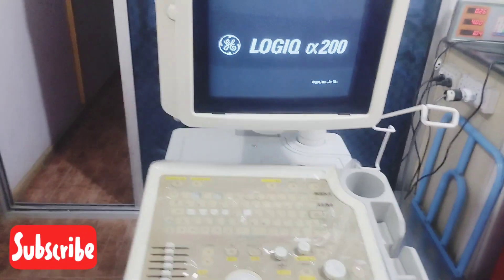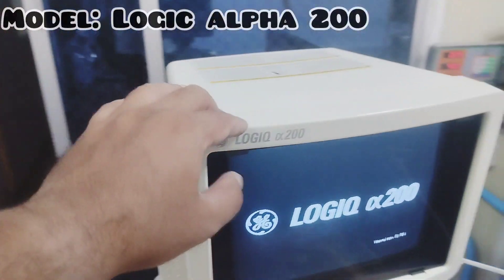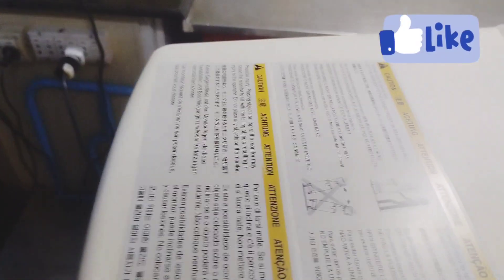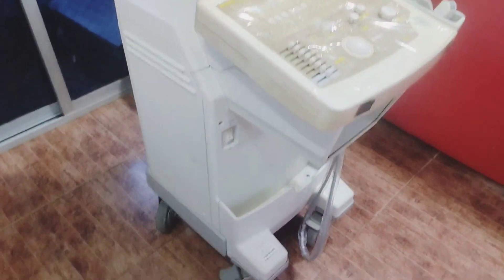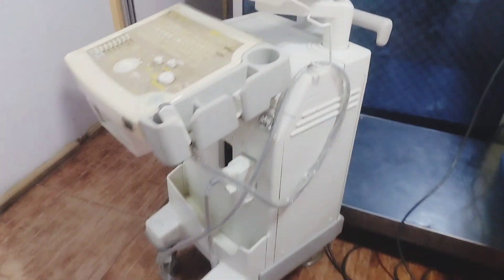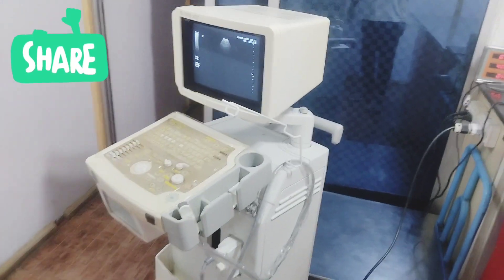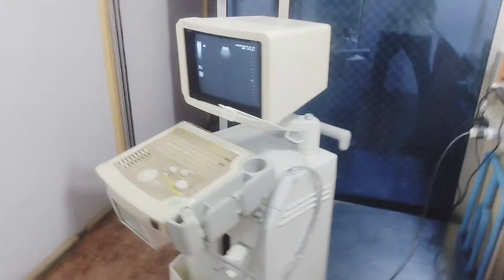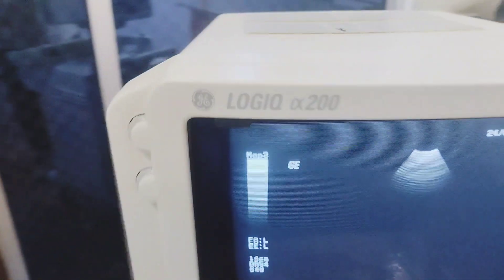What is the model? Logic 200 Alpha. Chinese or Japanese? Chinese — Airbus, Mashallah, it's a fresh Airbus. It's a classic tech. It's a portable ultrasound machine. It's a Logic.